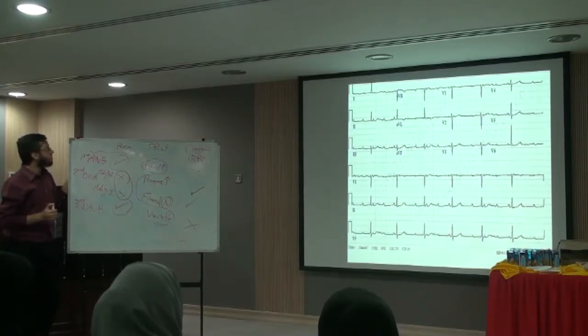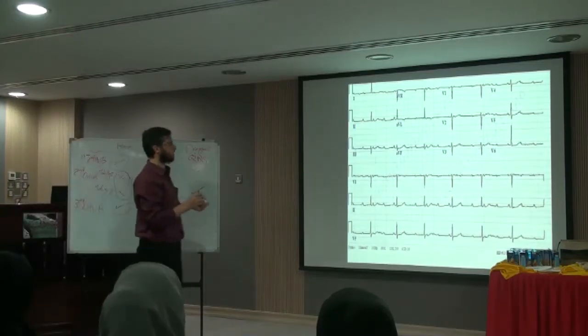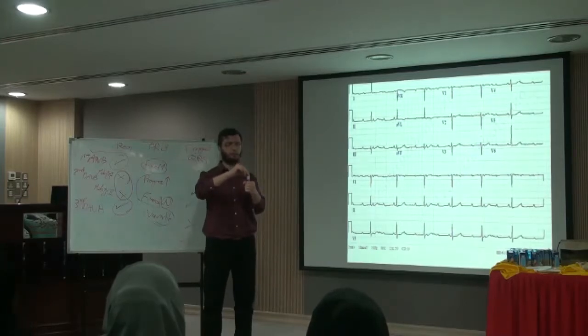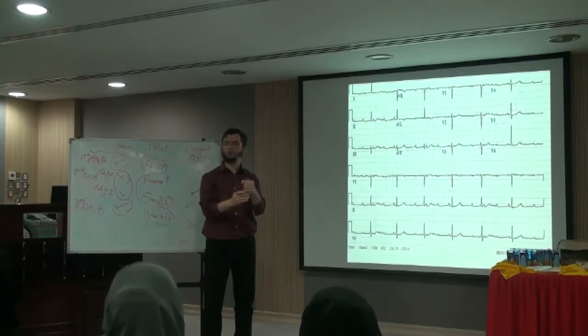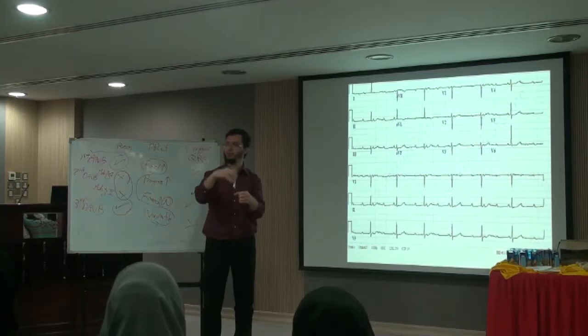So the first degree, what is happening actually is that the electrical activity is going through the AV node, and the AV node is blocking the conduction much more than normal. So it slows down the electrical activity more than usual. Next one will come. The AV node has recovered, yes, but it's not refractory, it's still diseased. So it slows the conduction at the same speed every time.